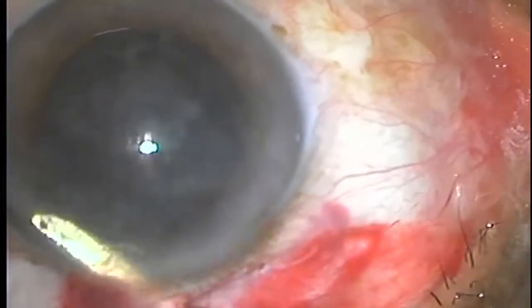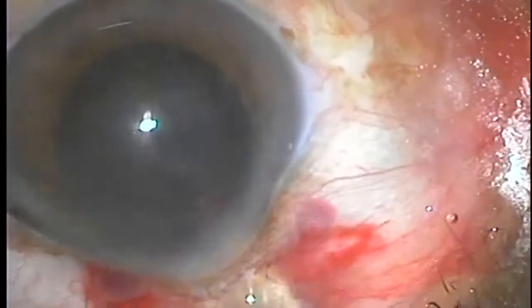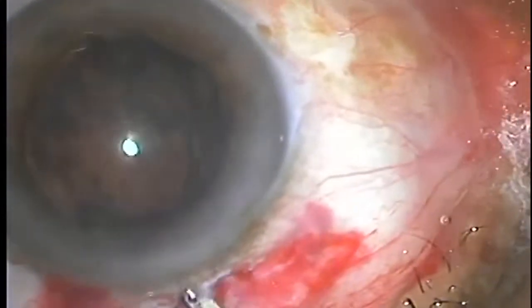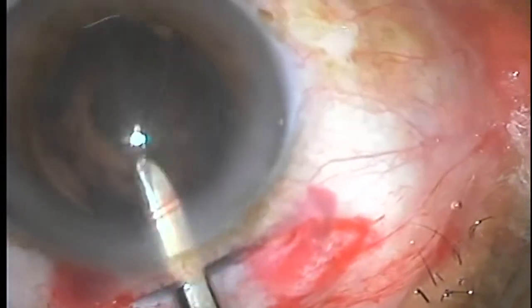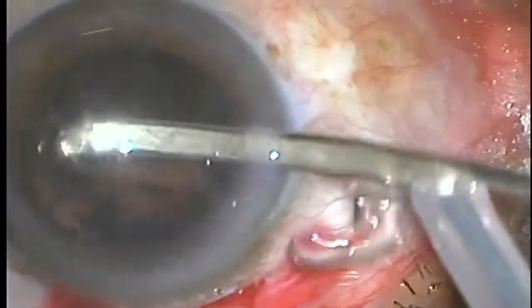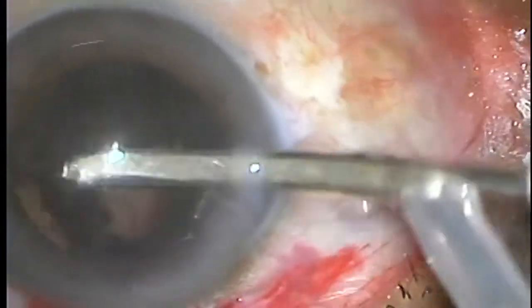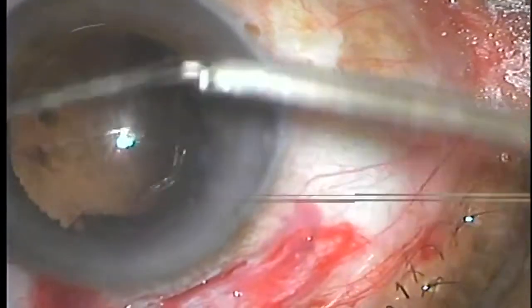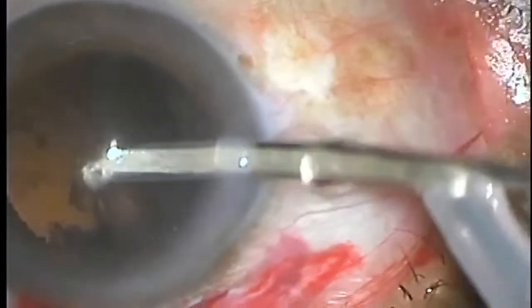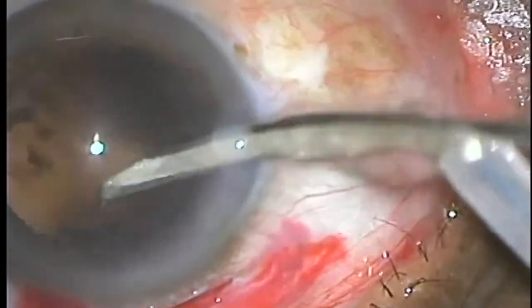The entire procedure is done by instilling two drops of paracain at the start of surgery. The epinucleus is washed out by pressing the posterior lip, and care is taken to ensure that the anterior chamber is maintained deep throughout. The cortical wash is done using the side port incision. The anterior lip of the cortex is aspirated out, and finally the sub-incisional cortex is removed — this requires care not to touch the posterior capsule.